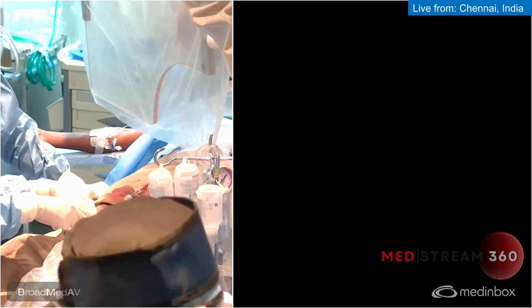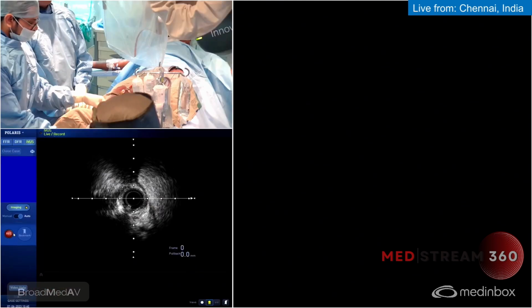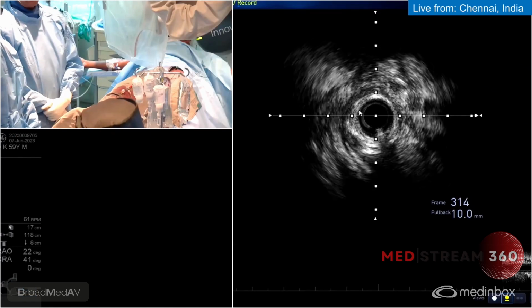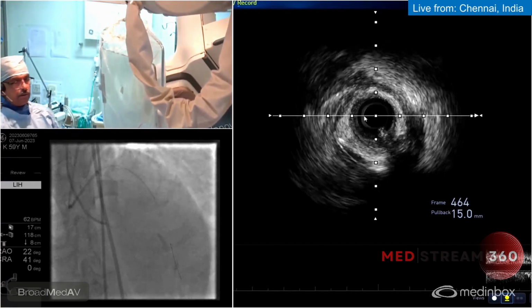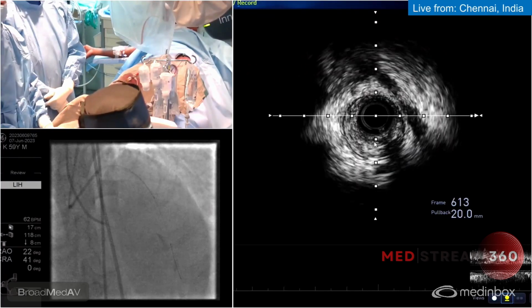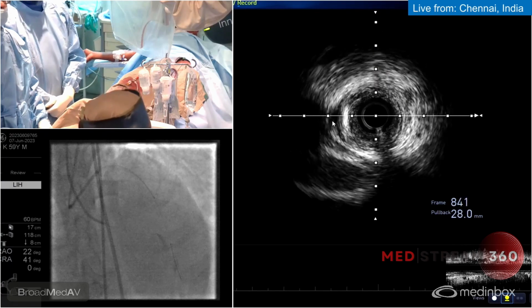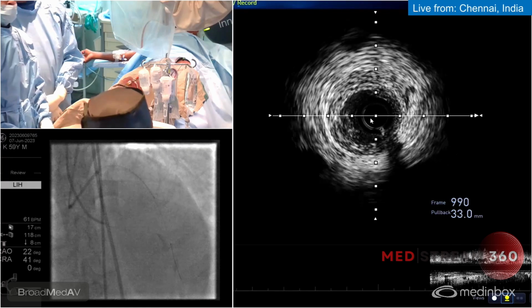So we can see the distal vessels are like chronically hypoperfused vessels. So it is hugging the catheter wall, which we generally expect in CTO after opening with the smaller balloon. The catheter size is 1 millimeter. So the vessels are going to be 1.2 millimeter in the distal most area where we have started, and as we are coming proximally we can see the vessel size is increasing. Though the lumen size is less, the vessel size is almost like 2.25. Now it's 2.5, and even some areas it shows even up to 3.